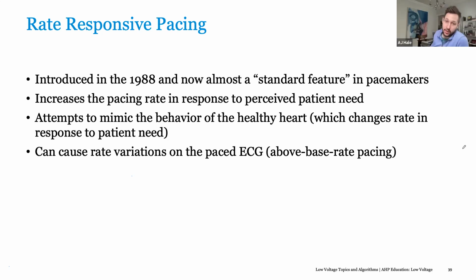Yeah, so intermittent AV block. If I have an Abbott device, I would set VIP on. The way VIP works is it searches for intrinsic activity, and then it adds an extra programmable delay, but I usually do a 200 millisecond addition. So if their AV delay is 200 milliseconds already, VIP is adding 200 milliseconds to that to make 400. Now this searches, I usually program it every 30 seconds.